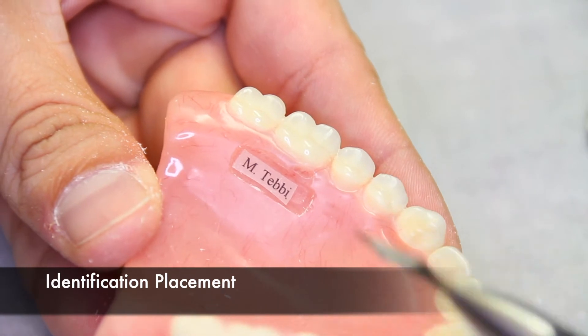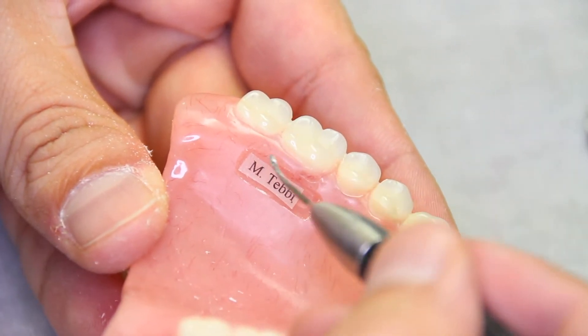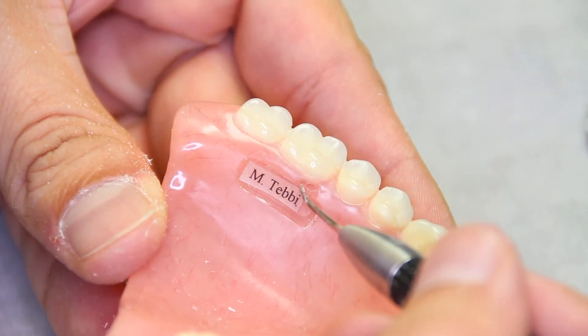Once the recess has been made, the ID tag can then be placed centered within the recess.